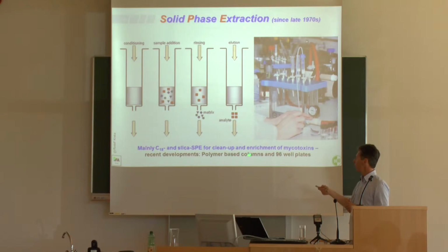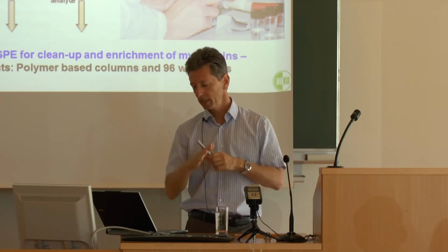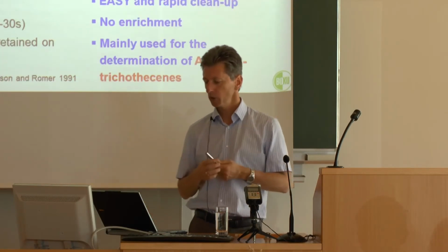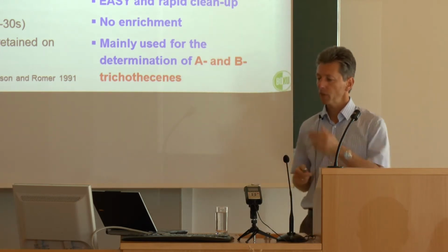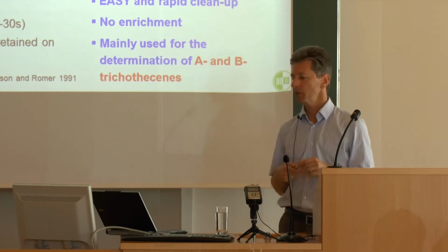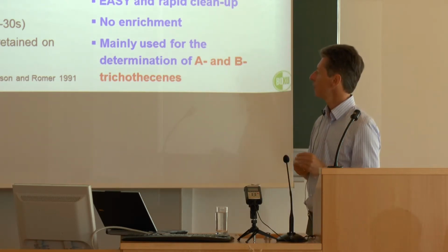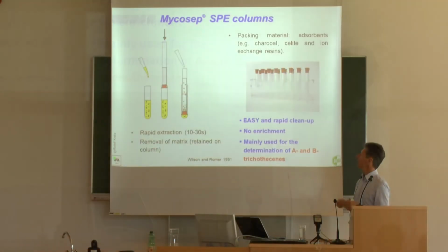Nowadays, polymer-based columns, even integrated in 96 well plates, are on the market, which have already got an integrated solid phase extraction material. This is a cleanup method which is quite well known on this campus, because it's sold by Romer Labs. They have developed the so-called MycoSep column.